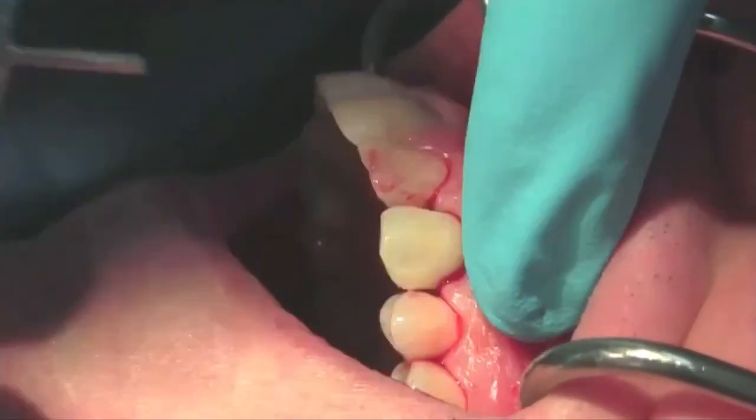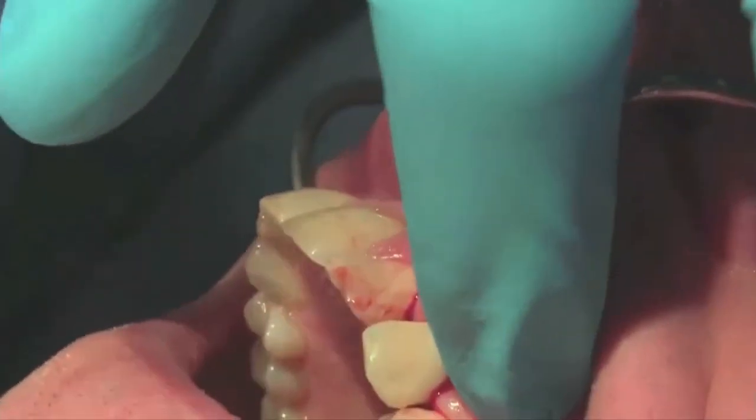If you're using any kind of bioactive modifier like PRF or PRGF or even PRP, you can go ahead and mix it with the Puros and utilize it. It will work very well. It will help you with the healing of the soft tissues, with the inflammation, and it will help to decrease pain. The patients usually don't complain about pain and inflammation when we utilize this type of procedure.